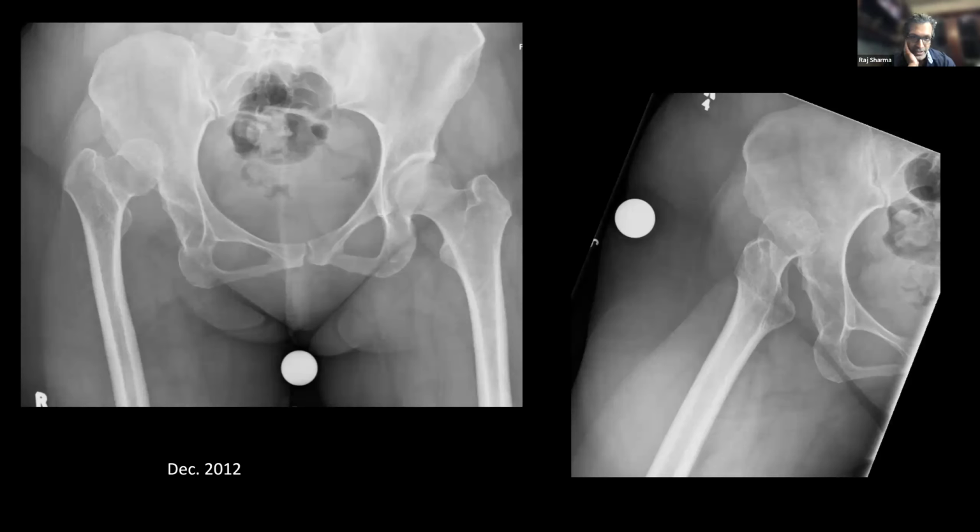Sure. Very challenging case. It looks more than 4 centimeters, to be honest with you. I would pre-op template this exactly, figure out the leg length discrepancy, because to me that looks a bit more than 4 centimeters. Questions come into consideration: how much do I want to lengthen the leg before I start worrying about sciatic nerve palsies and other such issues? So in this case, I would template it out. I'm suspecting maybe radiographically more than 4 centimeters.